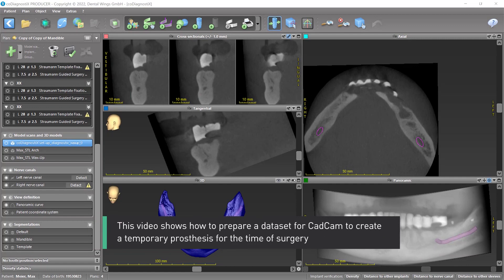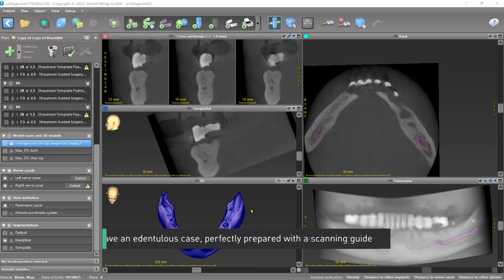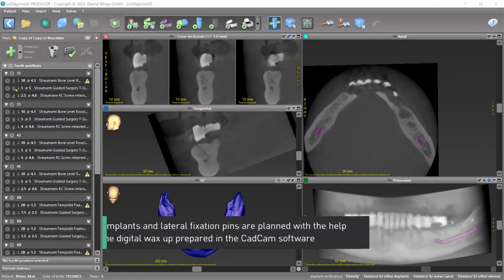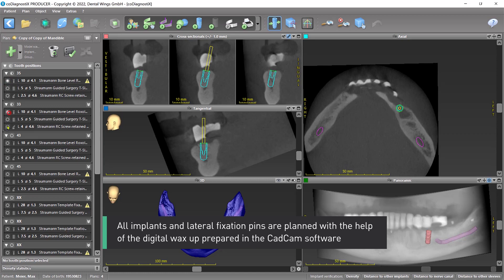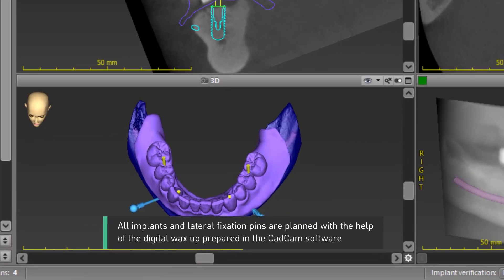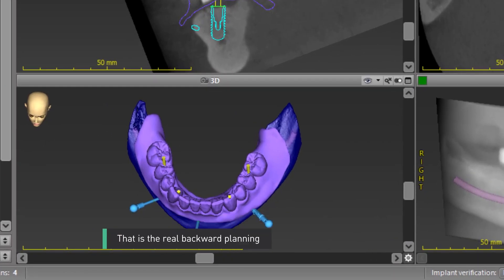This video shows how to prepare a dataset for CAD-CAM to create a temporary prosthesis for the time of surgery. We have an edentulous case perfectly prepared with a scanning guide. All implants and lateral fixation pins are planned with the help of the digital wax-up prepared in the CAD-CAM software. That is the real backward planning.